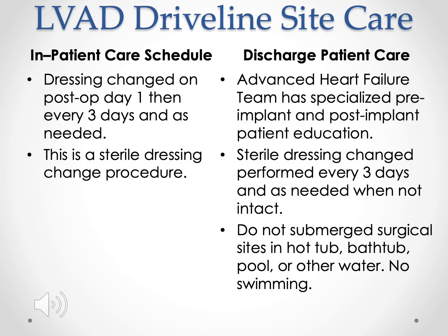Patients receiving a left ventricular assist device go through extensive education and training with the advanced heart failure team prior to receiving their device, during their hospitalization, and again after discharge. The slides below are a brief overview of left ventricular assist device driveline site care.